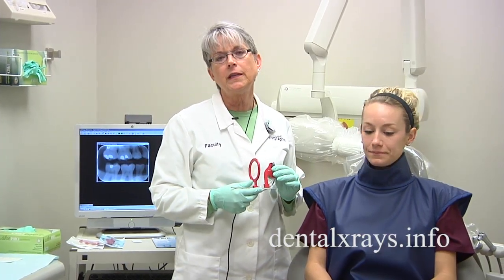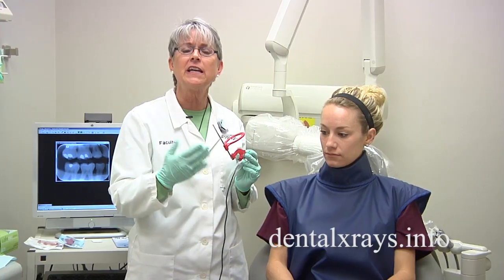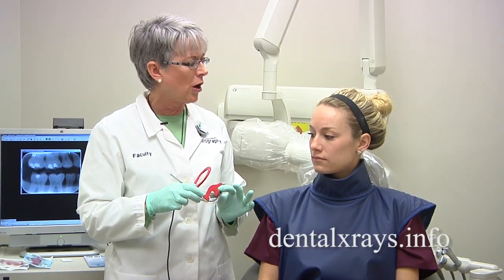We've had a lot of questions about how to get bite wings to include the distal of the canine using a sensor on a narrow arch, or actually any arch at all. Sometimes it's just hard to get that distal of the canine because the sensors are a little thicker and they're a little harder.